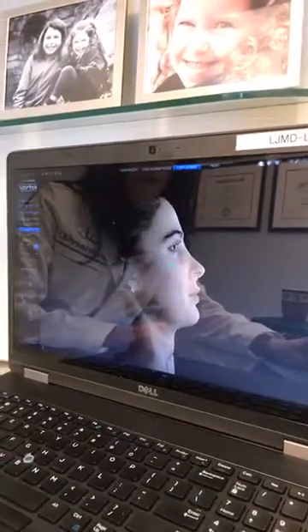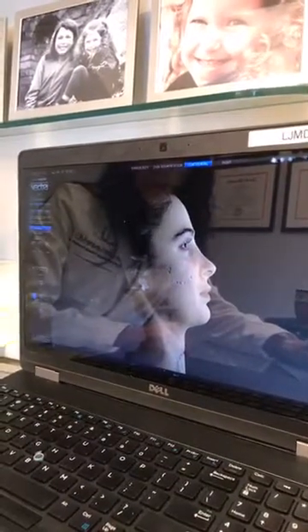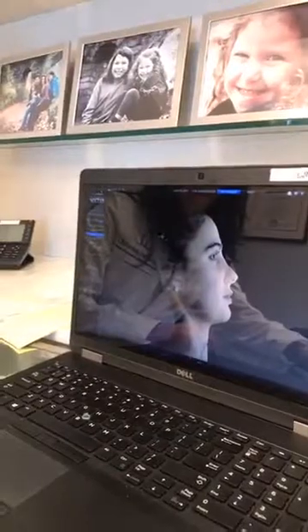We can also take areas, let's see, sorry, let me just undo that, here we go.